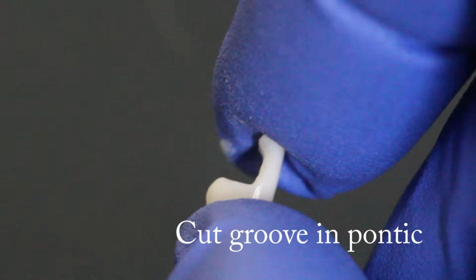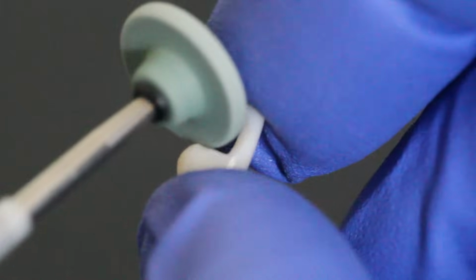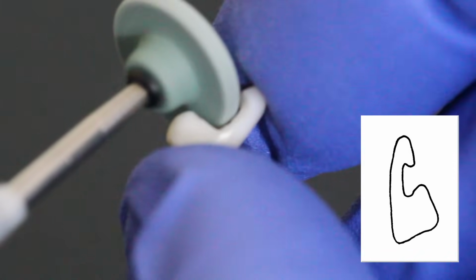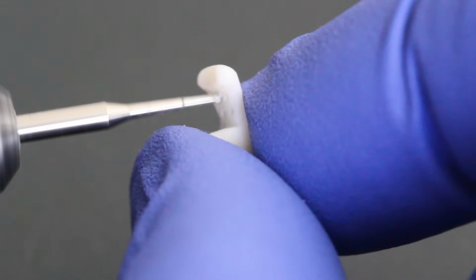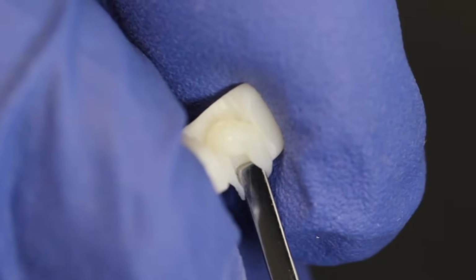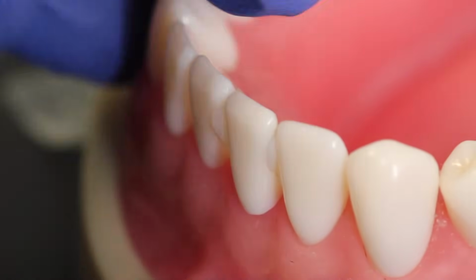If using an acrylic denture tooth or a natural crown as a pontic, cut a lingual channel to accommodate the ribbon framework. If using an acrylic denture tooth, you will be relying on mechanical retention, so make undercuts within the groove preparation in the acrylic denture tooth. Small holes can be placed in the groove for added mechanical retention using a small burr. Fill the groove with composite, seat the pontic on the framework, check placement, and polymerize.